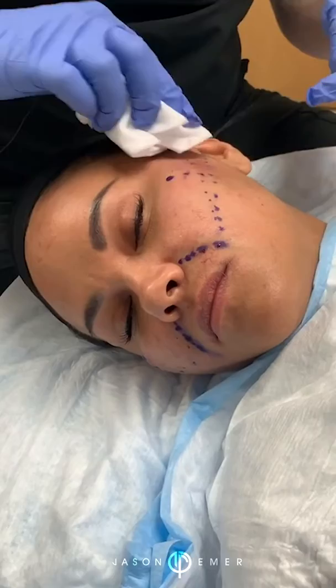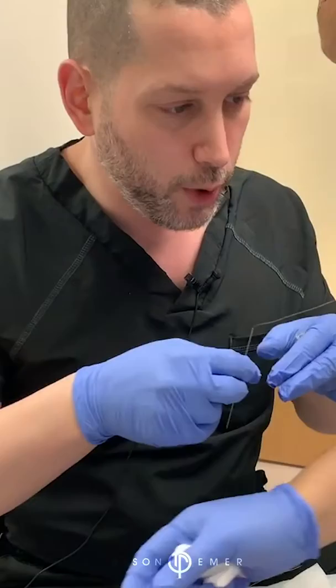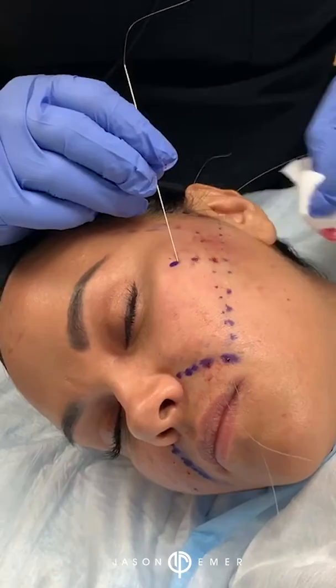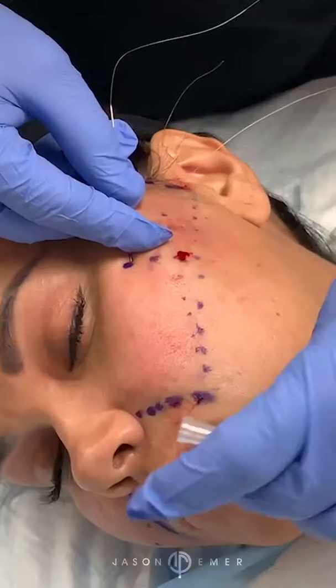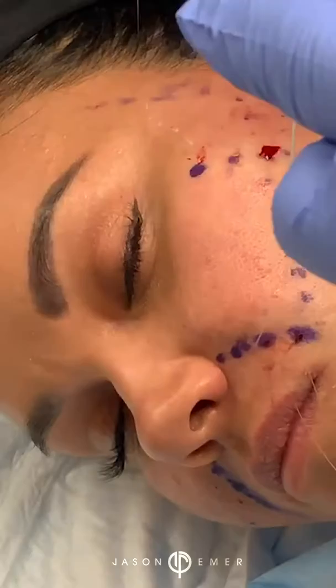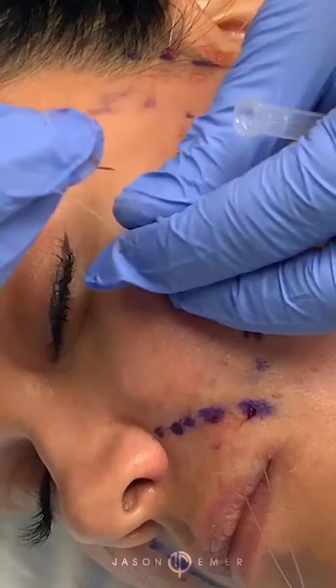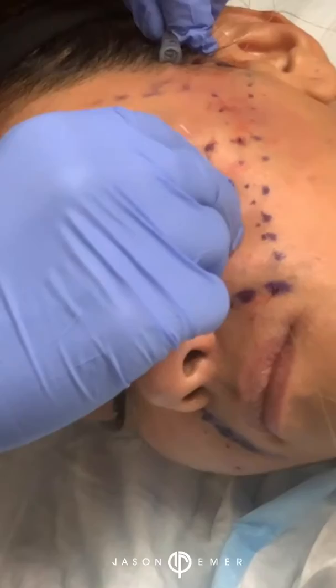There are other things we can do — some fillers to get some lifting and soften the line, etc. But this is a good actual procedure to give her some tightening. Now, there are different types of threads. There's one called PDO that has little barbs on them. Those are also good, but I've found they don't last as long, and some people — especially active younger people — they can move. So there's nothing wrong with them, and they can be added. But I find that the InstaLift threads give you a much softer look, they're more preventative, you can add to them, and they're very vectoring — I can create shape and contour. I'm going all the way up into the hairline to give a nice lift in that area.